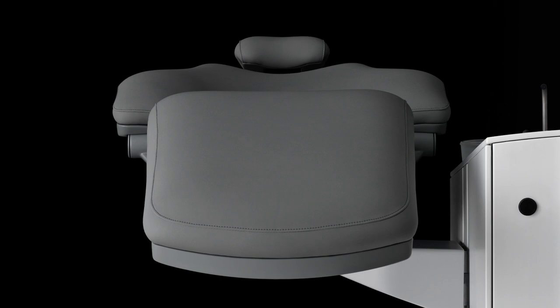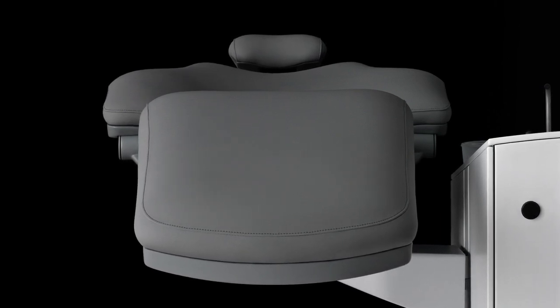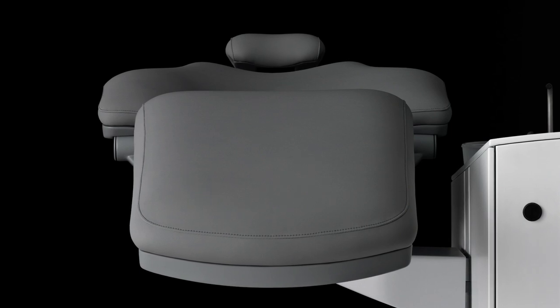We recommend that you clean the entire upholstery with clear water once a month to remove excess disinfection and cleaning material from the fabric.